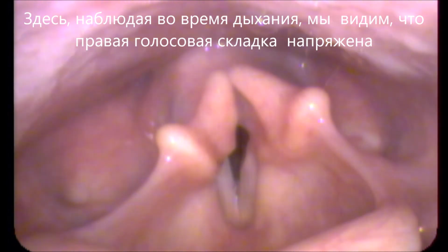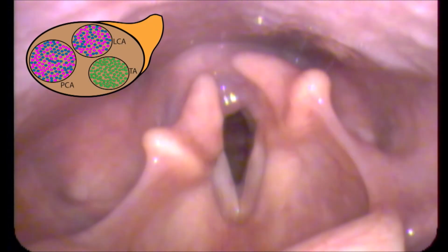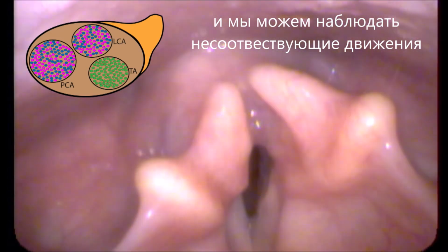While watching respiration here, we notice that there's tension in the right vocal cord, there's an unsteadiness, and if we watch for a while, we'll actually see some inappropriate movement, a twitch in the wrong direction.